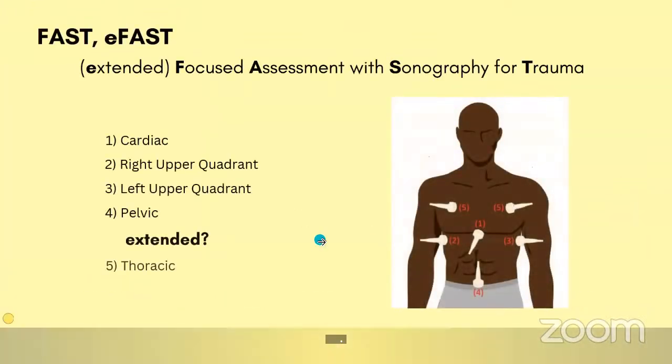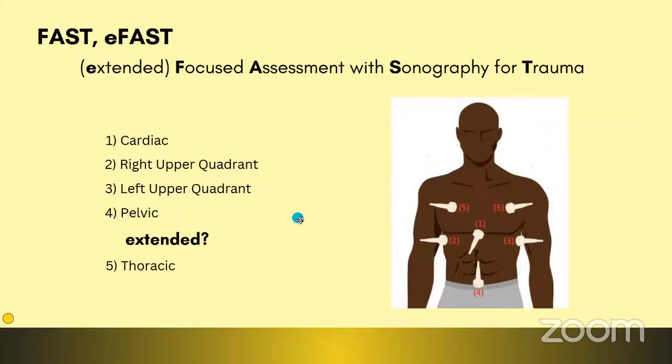Okay, moving on. Let's go on explaining the topic proper: FAST and eFAST. FAST full form is focused assessment with sonography for trauma, and E is just an extension of it. So this is a very small and more specific entity when discussing ultrasonography.